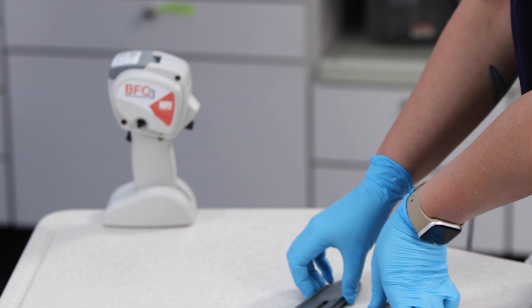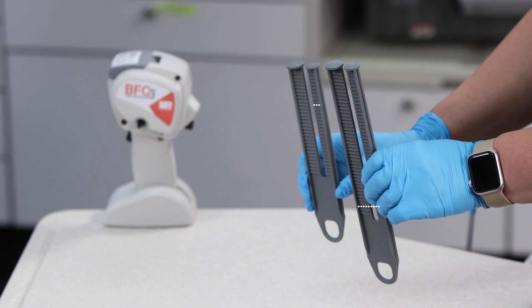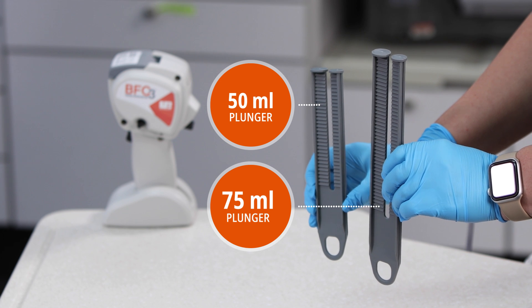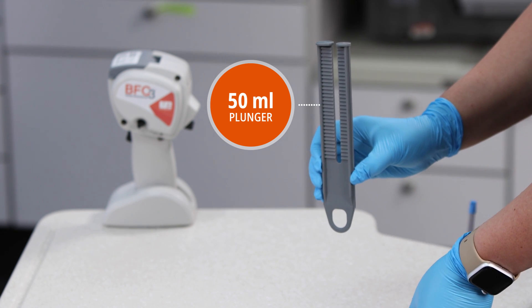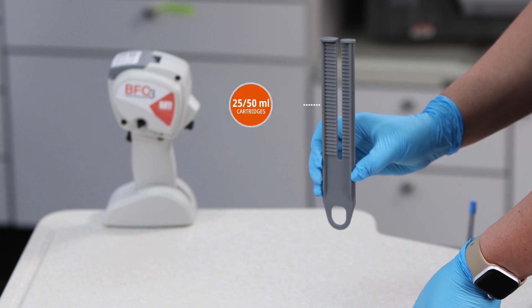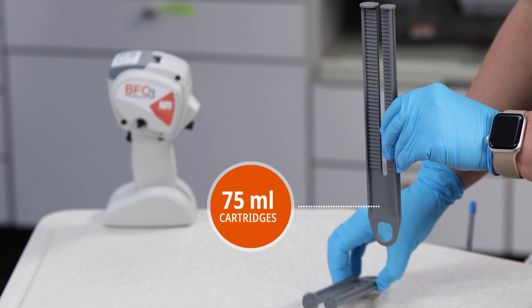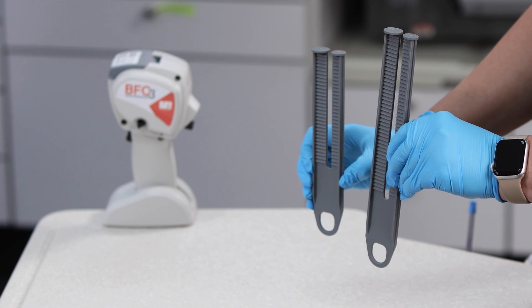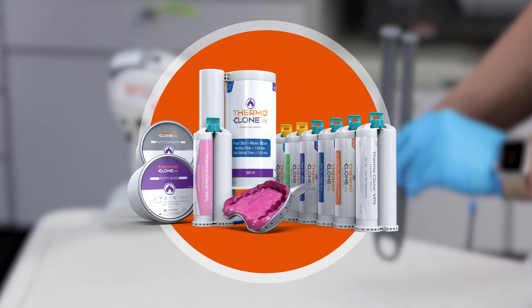To prepare the impression gun for use, select the 50-milliliter plunger or 75-milliliter plunger as appropriate for your material cartridge. Use the shorter plunger for 25-milliliter and 50-milliliter cartridges and the longer plunger for 75-milliliter cartridges. The BFC3 is ideal for Ultradent's family of impression materials as well as other compatible brands in other useful sizes.